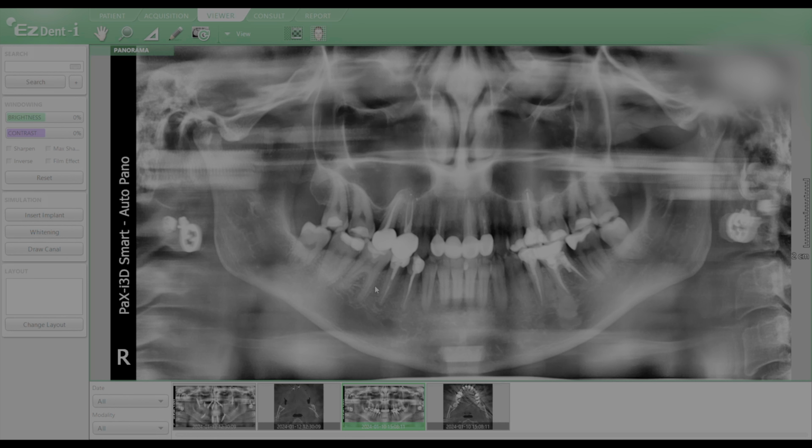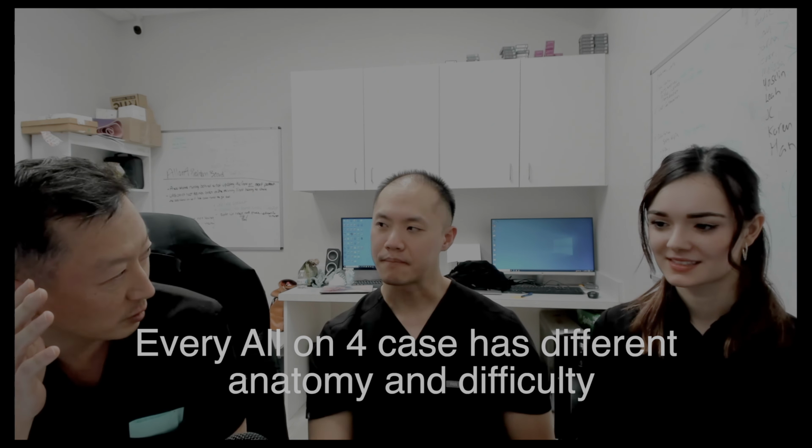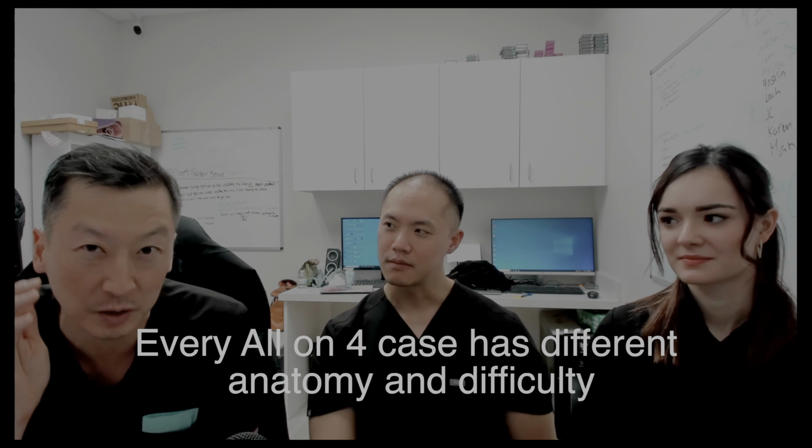Humongous sinuses. Right. Yeah, so honestly, when I looked at this 3D scan, this is where we tell patients not every all-on-4 case is built similarly. No matter how many we do, from a surgical perspective, there are some cases that just stress the heck out of us.